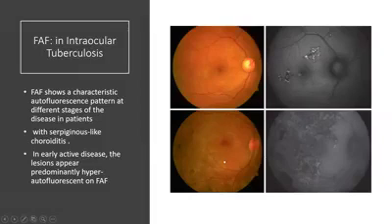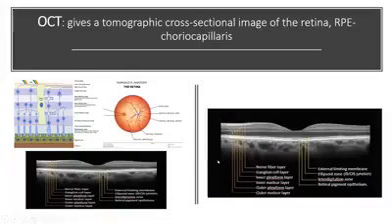When I look at the patient below, we can see extensive lesions all over the fundus, and I need to know whether these are healed lesions or active lesions. Just look at the fundus autofluorescence, and you can see there is an area of hyperautofluorescence here, which indicates that the disease is active. So I need to continue with the treatment.